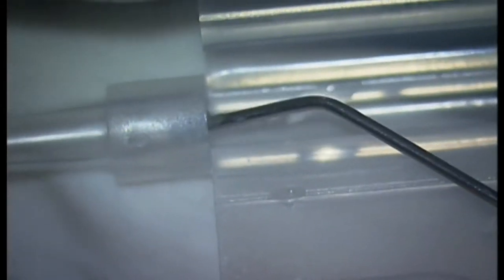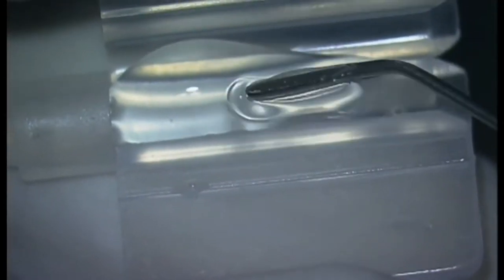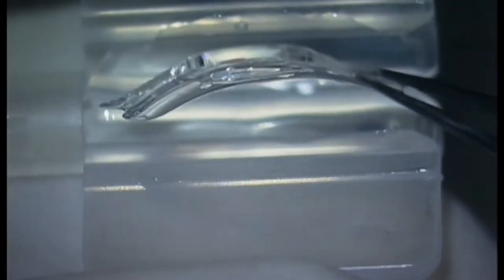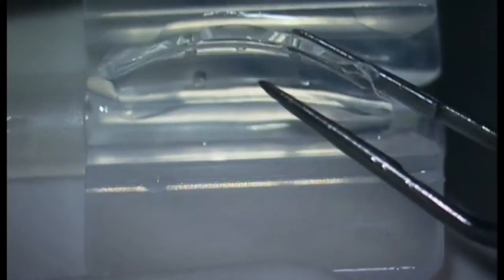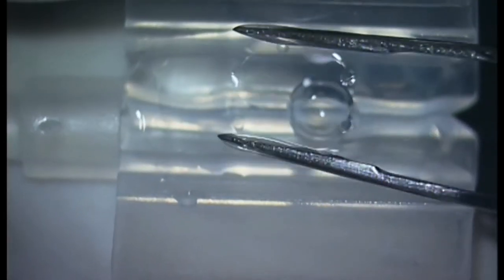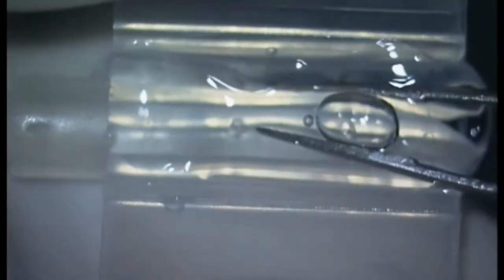Next, viscoelastics are injected along the cannula and base of the butterfly cartridge. RIOL with vault facing up is placed over the butterfly cartridge and gently tapped to lock it inside the base of the cartridge.